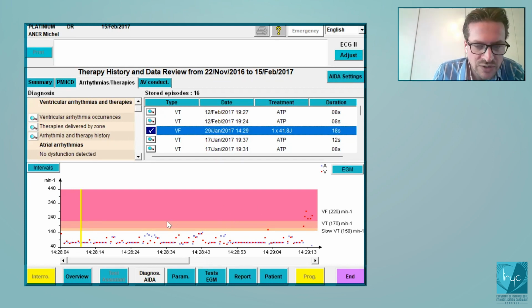They also like to make use of pink little screens with a lot of different colors, which can be a little bit more difficult because here you have some kind of dark pink on a lighter pink background, which makes it a bit difficult sometimes to see. But nevertheless, we can easily appreciate that there's a slow rhythm going on. I don't know if it's paced or not. Seems a bit fixed, so it's possible.